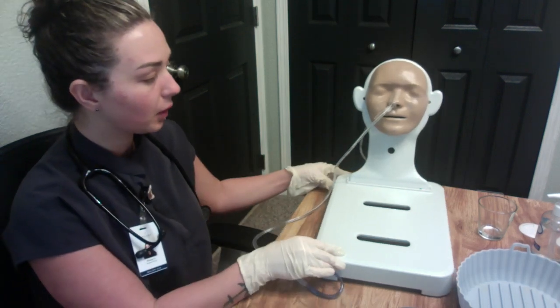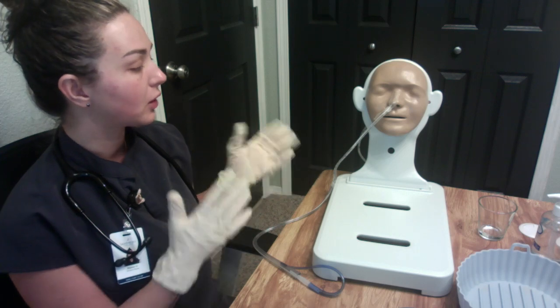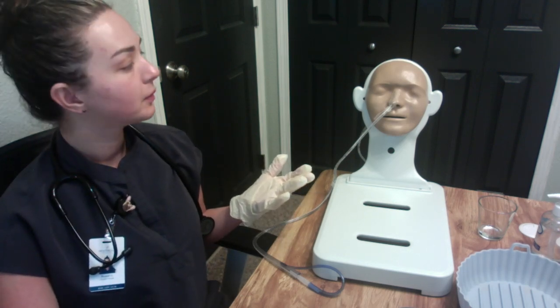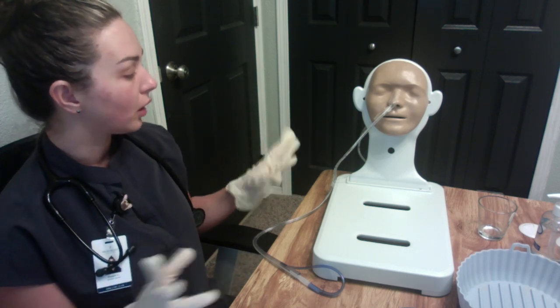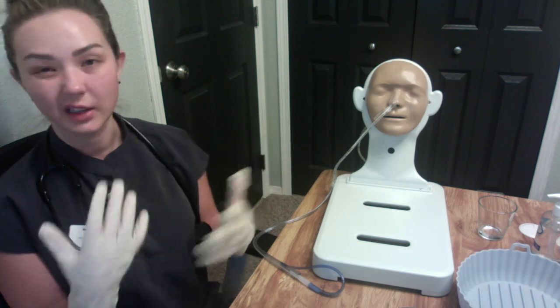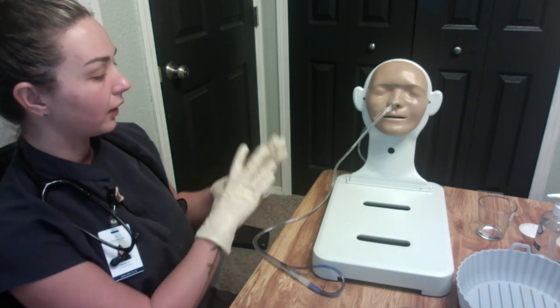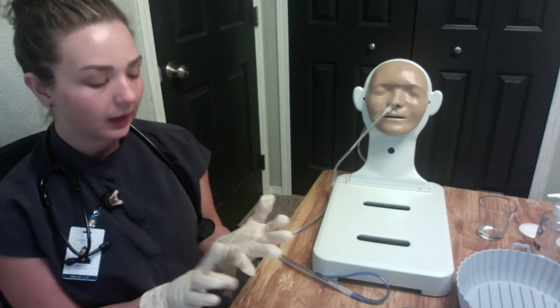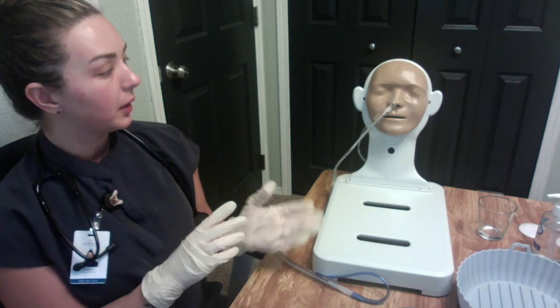And then we want to sit the patient back up, patient's already in high Fowler's. We would then want to make sure the patient is in a comfortable position, and that there weren't any concerns with the patient. We also want to assess and document anything coming from the tubing as far as drainage goes. We would also want to make sure that everything is patent, that there's nothing that is going to cause issues with feeding or with the feeding apparatus or the suction system. So we would definitely want to make sure that we're clamping the end of the tubing, things like that.